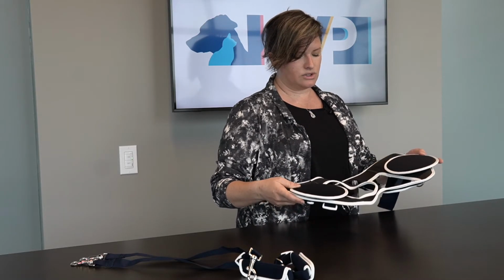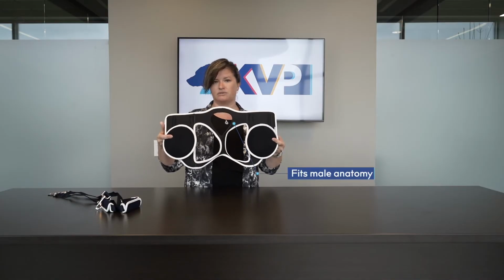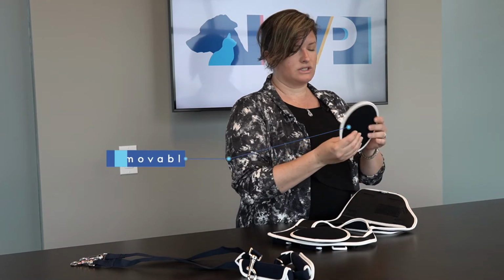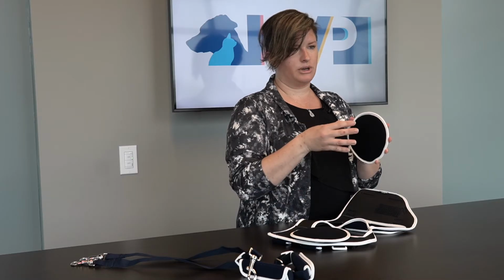So this brace is designed to have the hind legs go through the holes. They're able to void with this if we have a male patient, so don't worry about issues with that. We have compression disc here. These are removable. And I'm going to show you with these here in just a few minutes how we figure out exactly where we're going to have the placement of this. So during first fitting on a patient, you want to help with placement of the disc and have somebody else pull the rest of the brace up over the hip of the patient. Again, we'll demonstrate shortly.